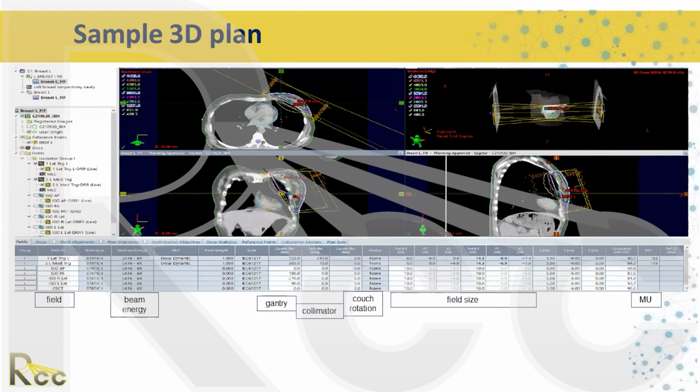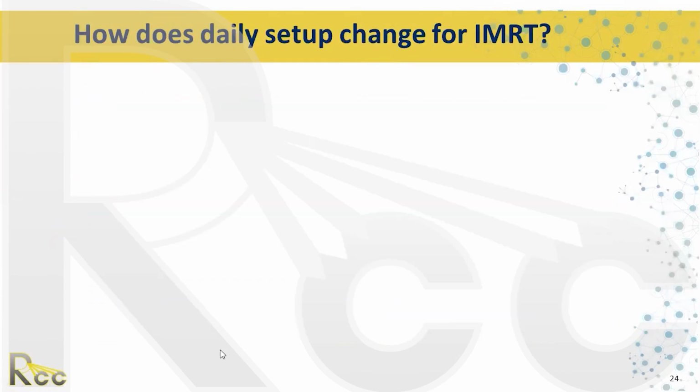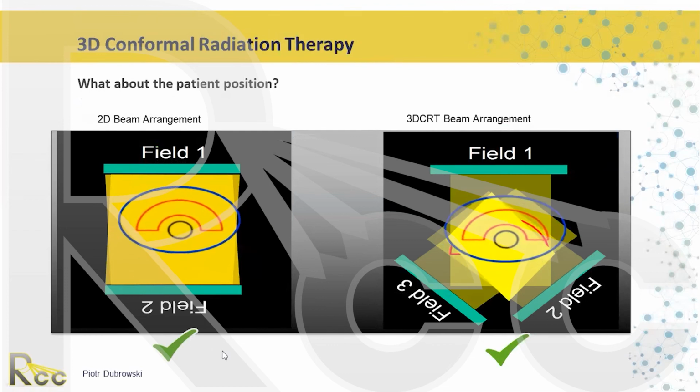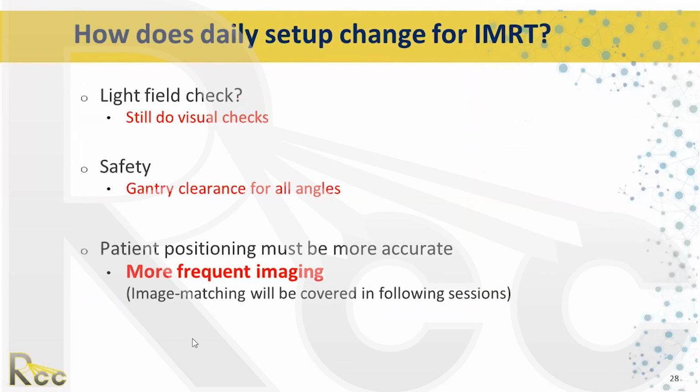So you spend a lot more time making sure the patient is in the correct position. Now the next question: how do you verify the treatment field during treatment? During treatment, you're only going to be checking the numbers. On the IMRT plan, you'll check these same numbers, and then you just make sure the MLCs are moving. There's no way for us to actually make sure that the MLCs are moving the appropriate amount. That's why physics does their second check. They're very diligent about that. So we just make sure that we have the correct plan motored up.